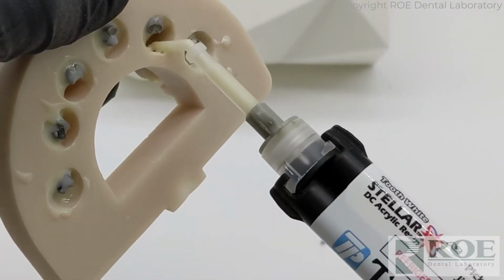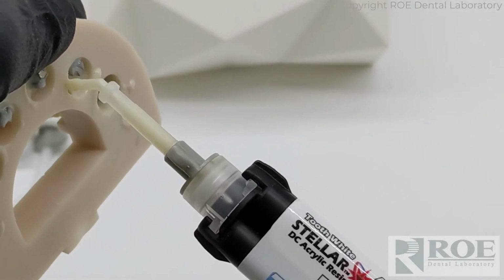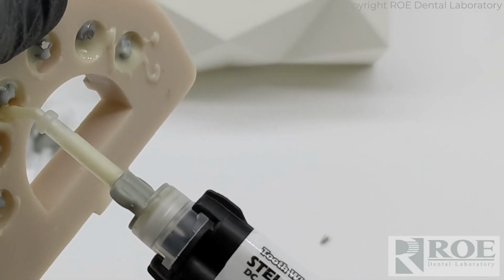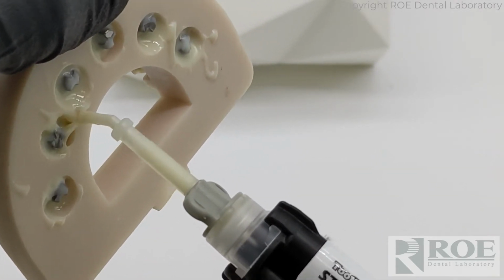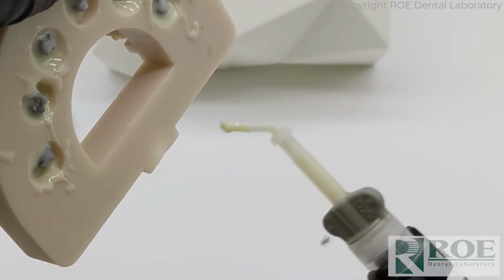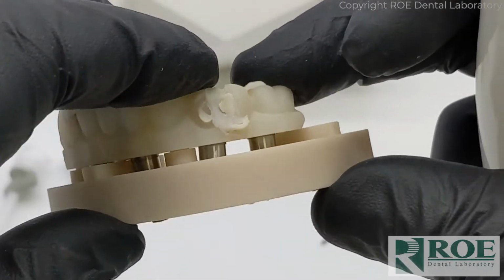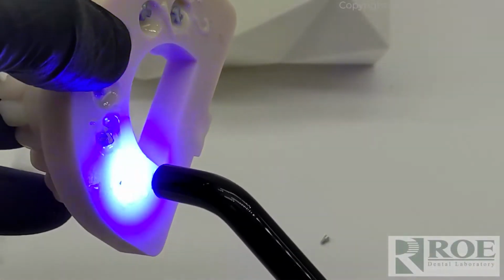This last abutment here was a little close to the edge, so I'm just flipping the model upside down now. Still vertical. I just rotated it so I can really nicely fill the void between the coping and the analog. Okay, backfill. And now, because Stellar is a dual cure material, I'm going to cure it. Let me make sure that the prosthetic is down. Very, very important. Make sure it's down before you start curing. Okay, it's down. So now just hit it.